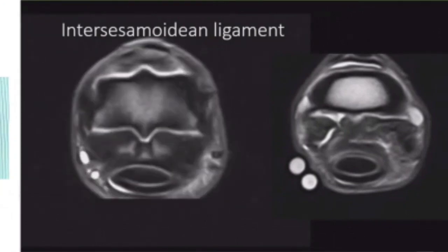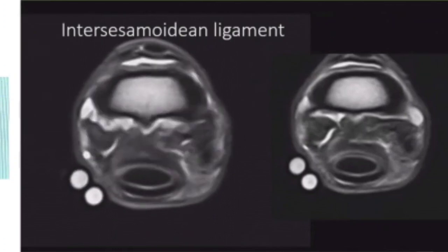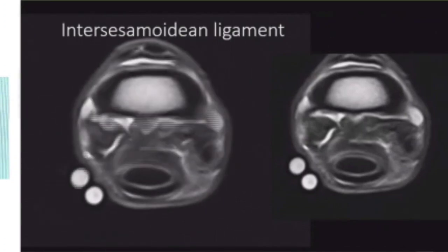So this movie is on high speed. It's had a lot of delicious Saudi Arabian coffee, I think, and it's going quite fast. So just focus over here for a minute.